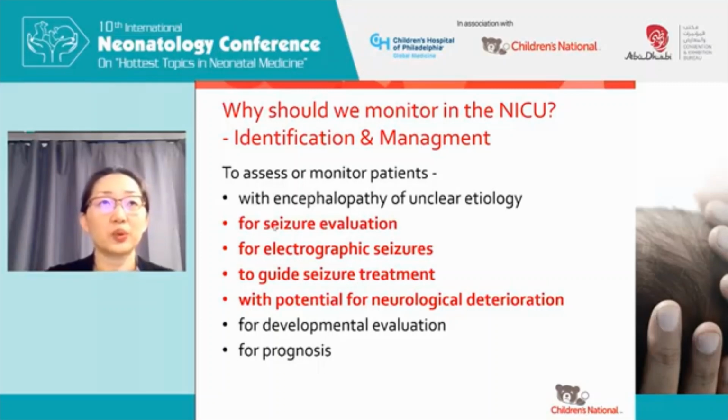For seizure evaluation and screening patients for seizures, to pick up electrographic seizures that may not have a clinical correlate. And then obviously, also to be able to know whether you're truly in seizure control or not after you've instituted treatments. Once you add on anticonvulsant medications, the seizures are likely to become electrographic only. They're also likely to get shorter, which is one of the limitations of AEEG in picking up brief seizures.